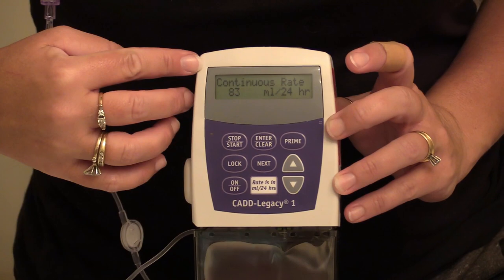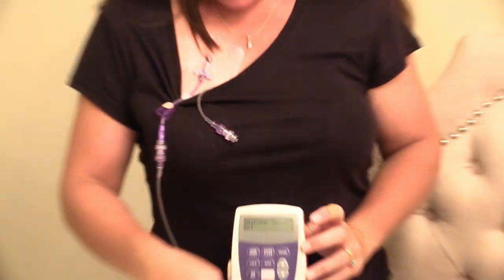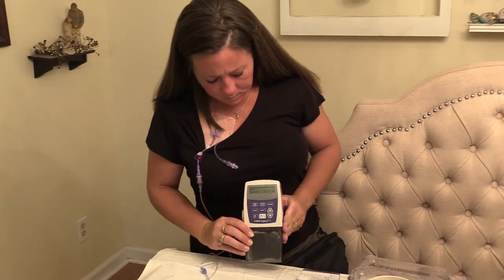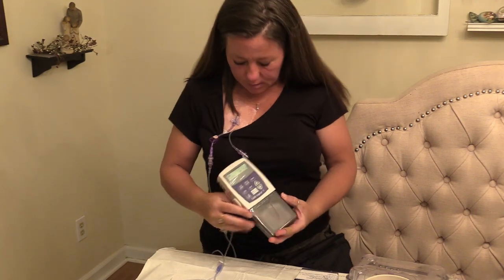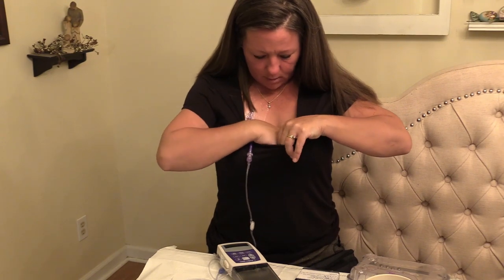It should say run, and it says 97.7 — because we primed the tubing. The volume in the reservoir is no longer at 100, it's at 97 since we had to prime this. It says run, so it's good to go. This old one I'm going to take off.